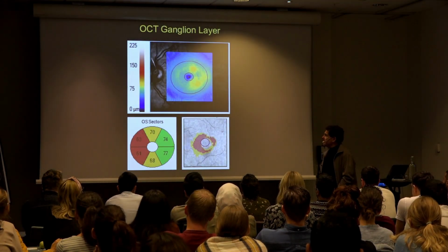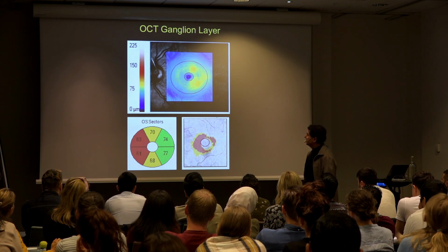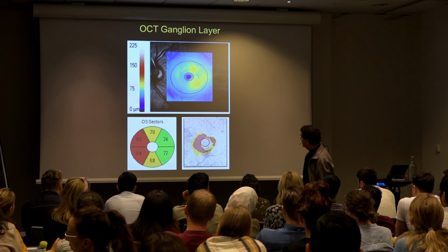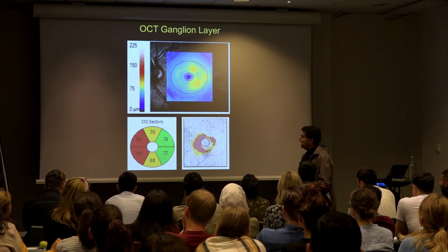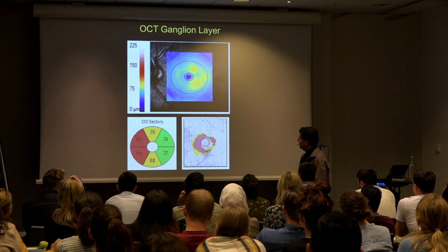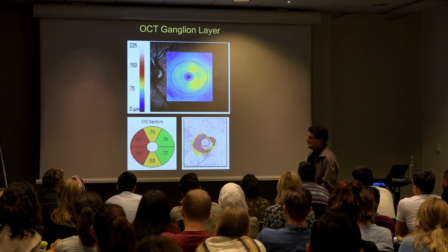And this was the ganglion cell thickness plot. So what do you think about that? The whole side is affected. What do you mean the whole side is affected? One side. Okay. So why does that ring any bells, or does that create some worry? If you look at that thickness map, which side is affected? The nasal retina side.